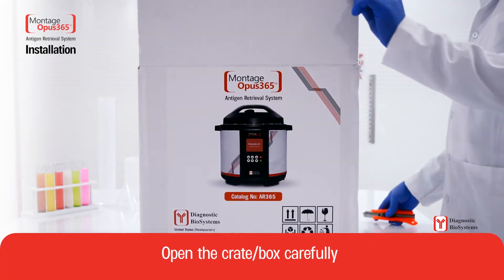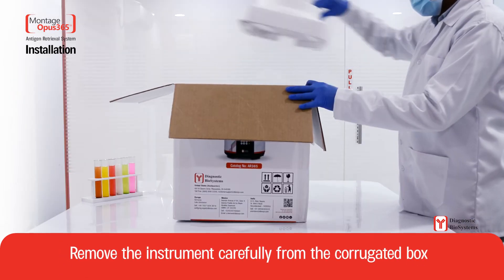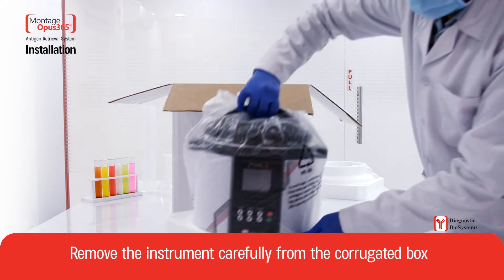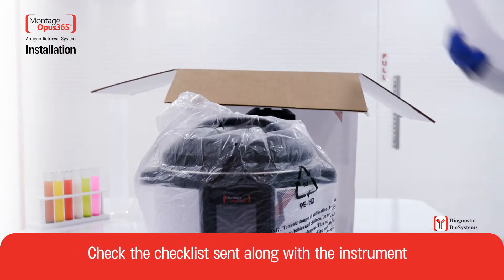Open the crate box carefully. Remove the instrument carefully from the corrugated box. Check the checklist sent along with the instrument.